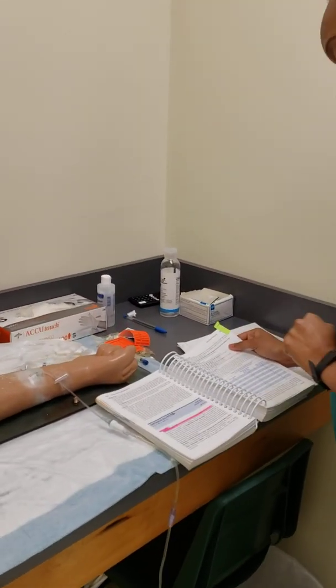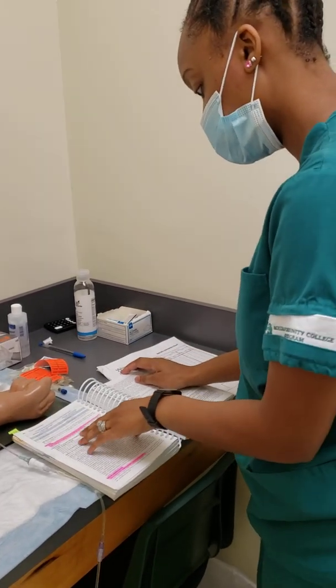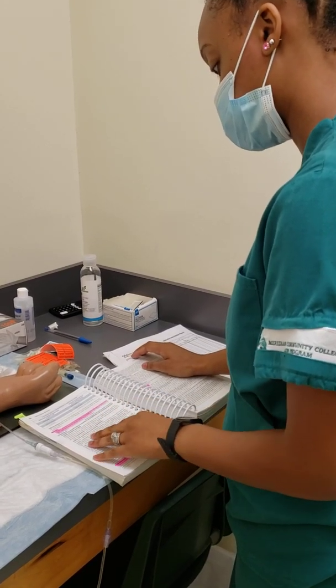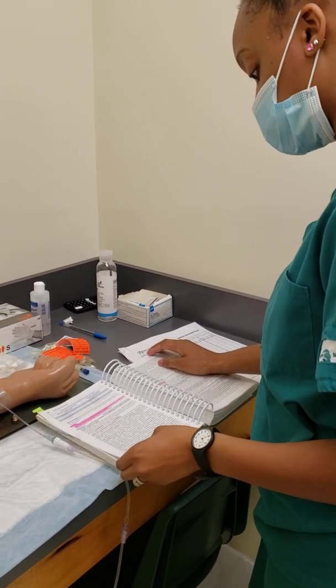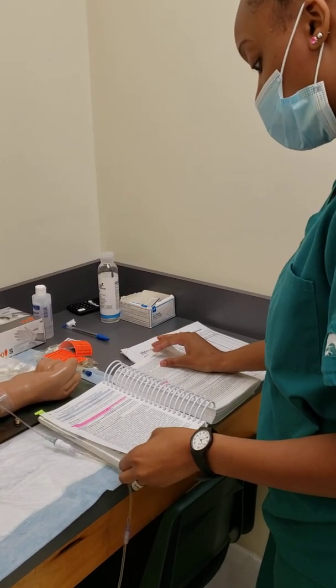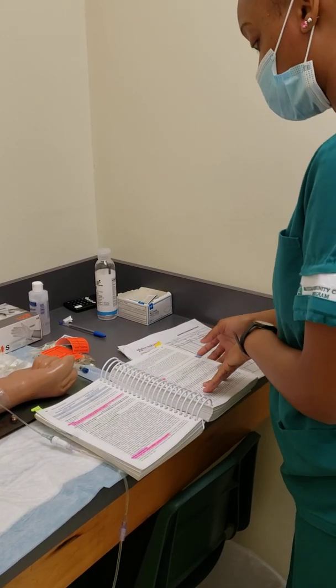Okay? And this gentamicin, it's an antibiotic, so she's going to be getting this for any infection that she has. It's divided into 3 doses, 1 milligram per kilogram every 8 hours. You can further dilute each single dose in 50 to 200 milliliters of IV normal saline or D5W. The rate of administration is each single dose properly diluted over 30 to 60 minutes. So we'll be giving this medication over an hour.